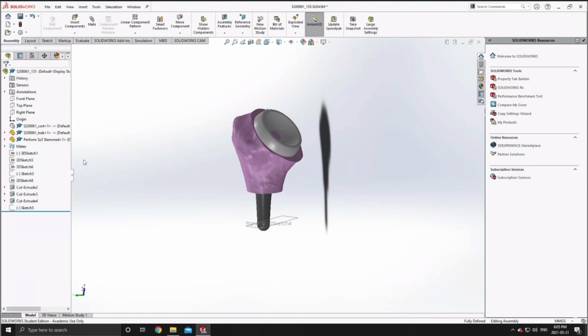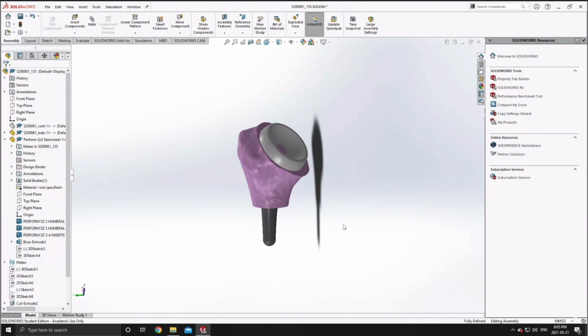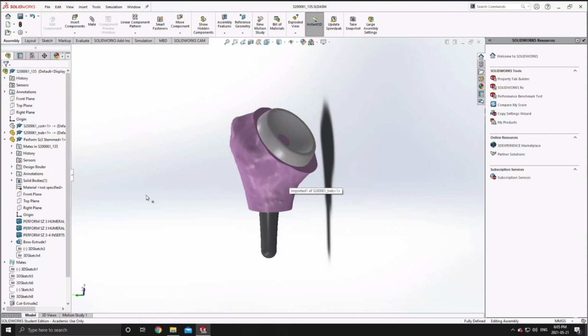But just to summarize the implant positioning metrics, my implant is centrally aligned on the same axis that I used to determine my neck shaft angle, which is of course orthogonal to the resection plane. The bone implant surface is naturally mated to the resection surface, and the stem is offset by that 1 millimeter laterally to the central axis of the humeral canal.